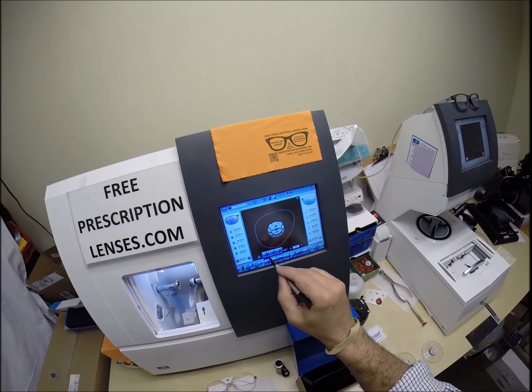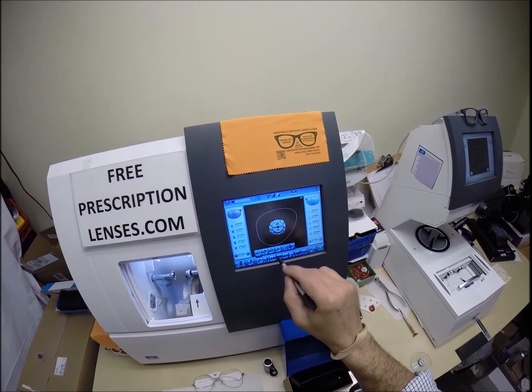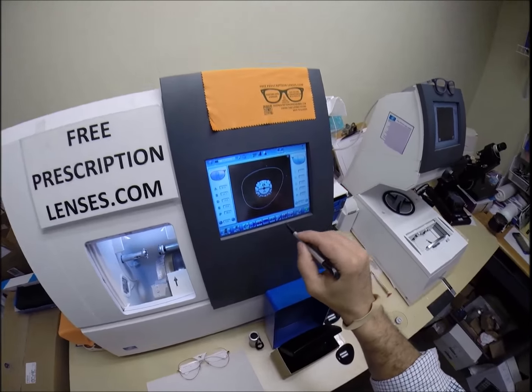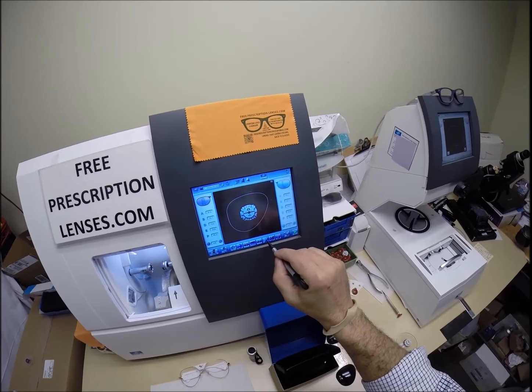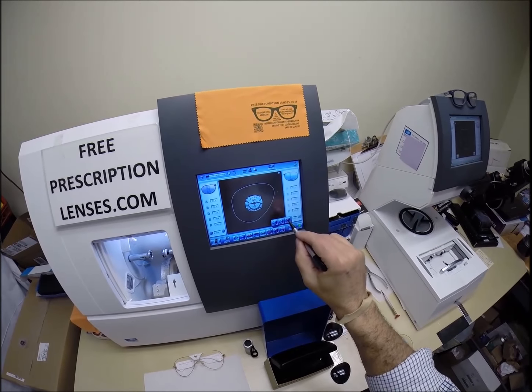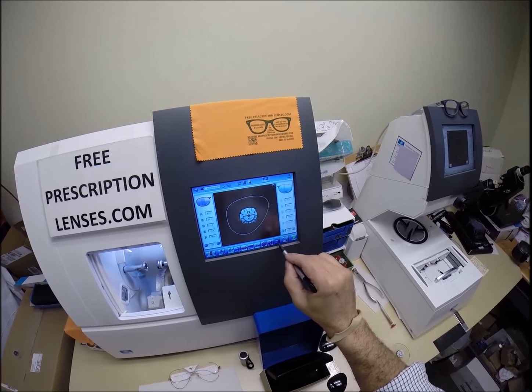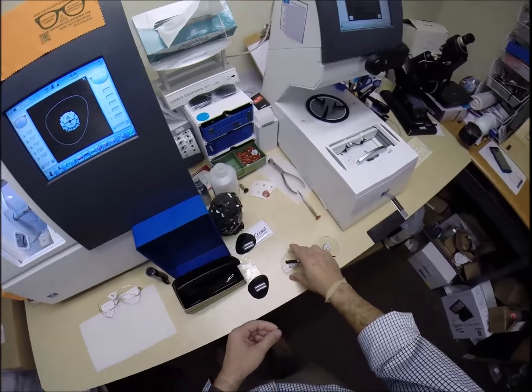Excuse me. These are polycarbonate lenses. If they were plastic, high index plastic or Trivex, I would select that, but we're going to stick with the safe and best lens possible, which is the polycarbonate in my opinion. I'm not going to polish the edge of the lens because it's not going to be seen. I'm not going to put a safety bevel on the front convex surface of the lens. I'm only going to put a safety bevel on the rear concave surface of the lens.